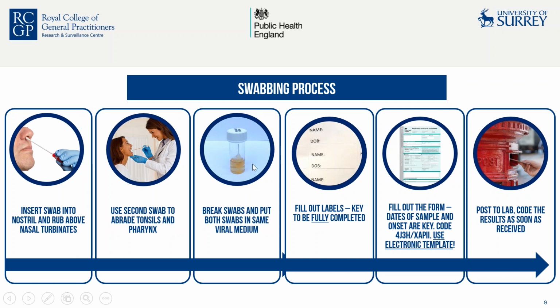Add the labels onto this bottle and package this up with the swabbing form. Please use the electronic template so it'll be quicker to have all the information on the swabbing form, and send it to the lab via the postage material provided. Now, this is just standard Royal Mail post. Please don't put it into the post that's going to your local trust lab for any test. This is a separate post via Royal Mail. We have a video of how to swab available on the dashboard, and additionally, we will also pay £5 per sample that is tested and coded into patient record.